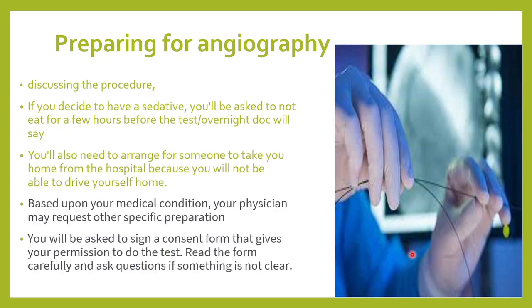You should discuss this procedure with your doctor, and if you decide to have a sedative, the doctor will tell you that you should not eat for a few hours before the test, or the doctor might instruct you regarding this before you come to the hospital. So remember that whatever the procedure, the doctor would instruct you on this, and you will have to follow the instructions. You will also need to arrange someone to take you from the hospital to your home, because you will not be able to drive, etc., after this procedure.